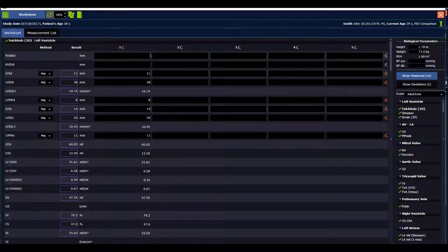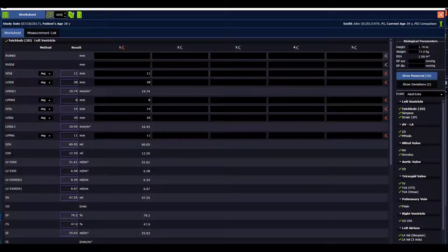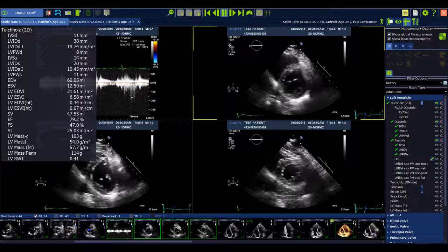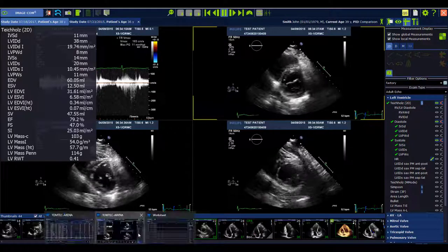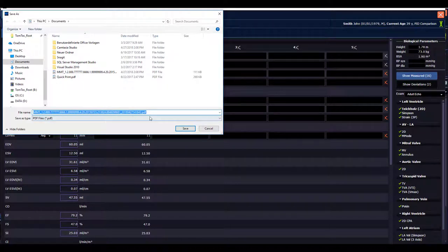The worksheet now offers GUI scaling, so you can make your worksheet bigger or smaller as needed by simply adjusting the buttons. You can export all the measurements into a text file and save it directly on your computer, or you can save the measurements as a PDF.